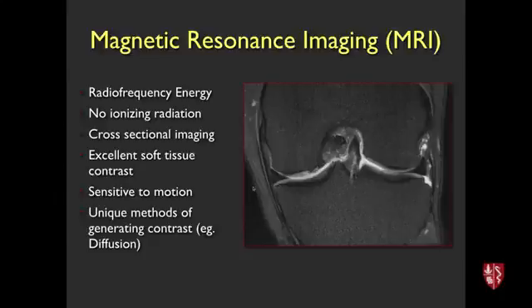Moving on, MRI. MRI is terrific technology, and the advance that's so important is moving to higher magnetic field strengths. We've been operating at about 1.5 Tesla for the last 20 years or so, and now things have moved towards 3 Tesla magnets. It's not revolutionary, it's evolutionary, but it produces better quality images and probably higher diagnostic confidence that way. This is radiofrequency energy, so it's much lower energy going into the patient.